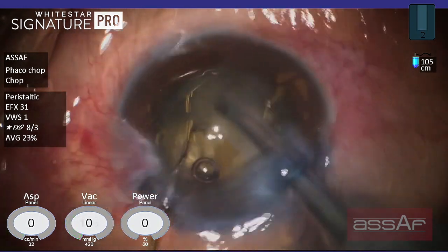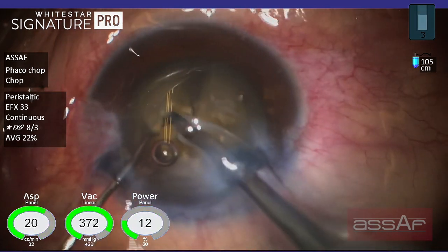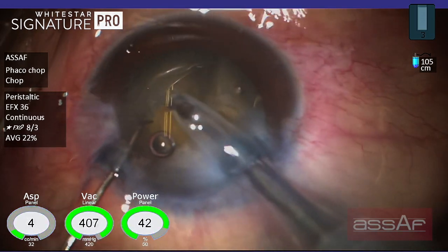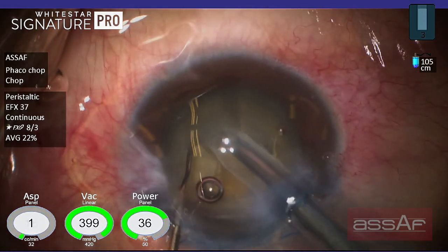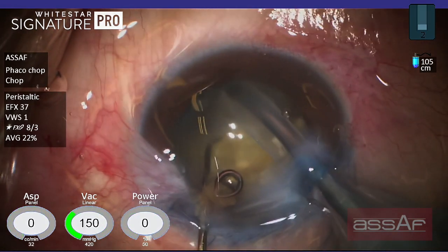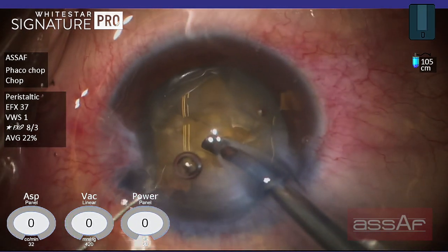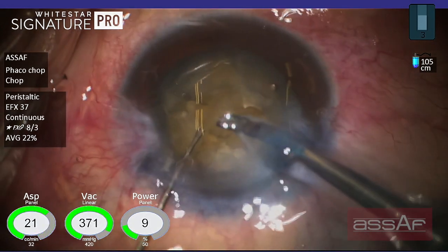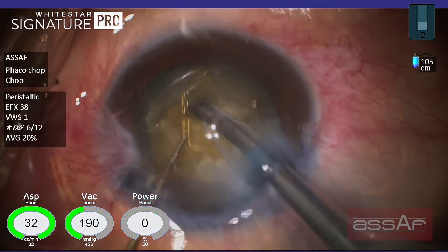In these cases of dense opaque leathery cataract, I don't insist on complete separation of the quadrants from each other, because I believe this might induce stress on the posterior capsule and may cause a tear of the posterior capsule and complicate the surgery. So I'm trying to divide the nucleus into as many small fragments as I can — it doesn't matter if these quadrants are still connected together or not.